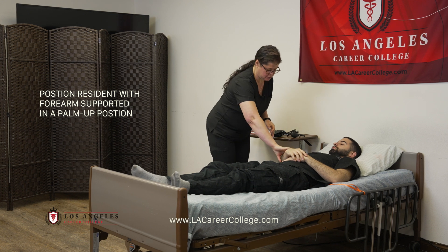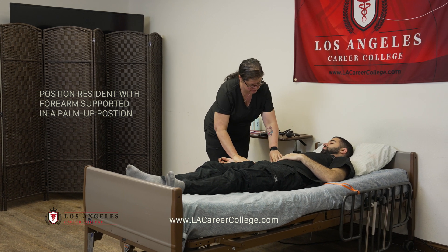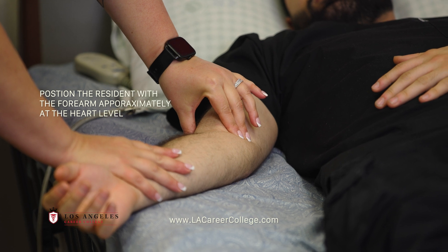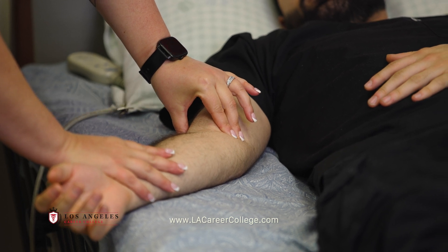I'm first going to locate your brachial pulse, which is on the inside of the upper arm, using the index and middle fingers.